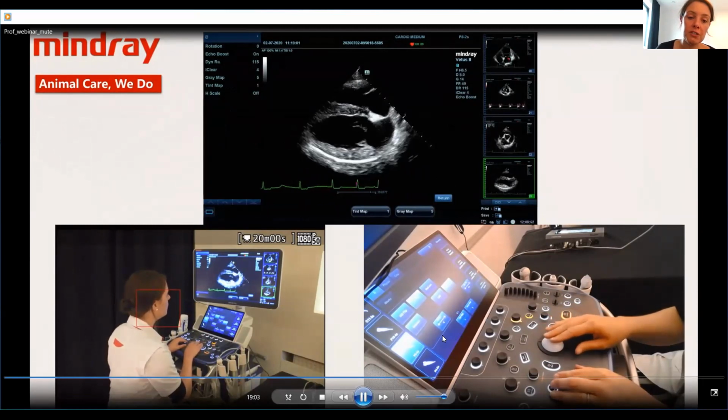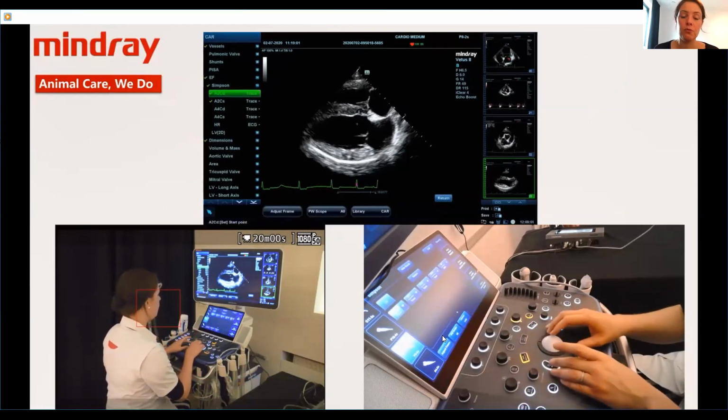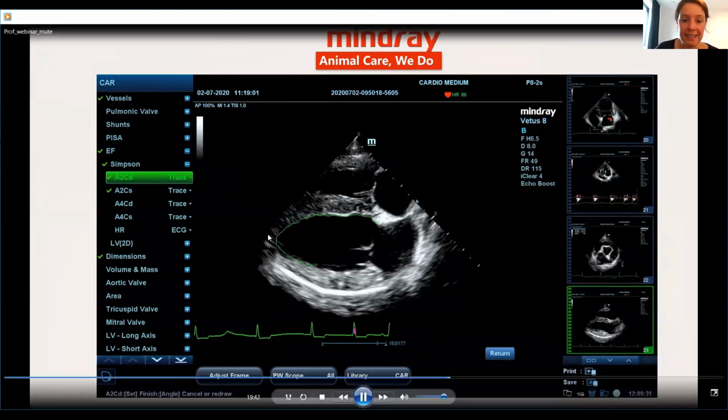And one of the 2D images that you can do on your right parasternal 4-chamber view is a volumetric measurement to look at the volume of the left ventricle. This is not an easy measurement. I do this now because I have my fixed order and I start with this and then I move on to the next measurements. But if you're a beginning echocardiographer, I would advise you to just start with the M-mode images. You have to make very good long axis views if you want to correctly measure the volume, because what you actually need is a good delineation of the apex.